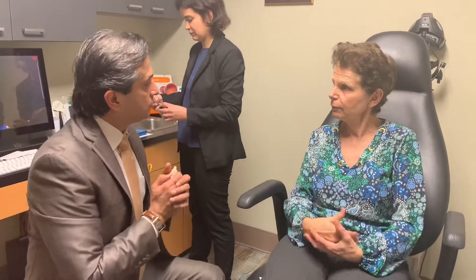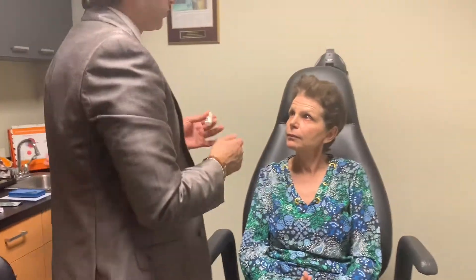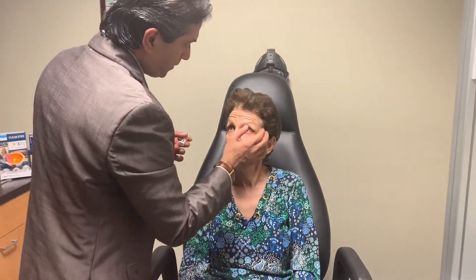So, Edith, we just finished by doing the dextensor, putting that into your lacrimal system here. How did you feel? Any pain at all? No, no pain at all. It was a piece of cake. Wonderful. Pleasure.